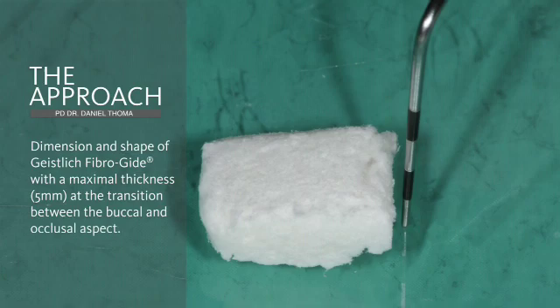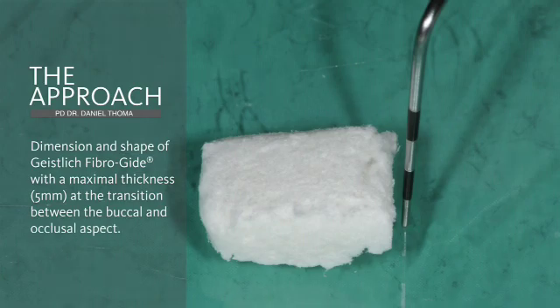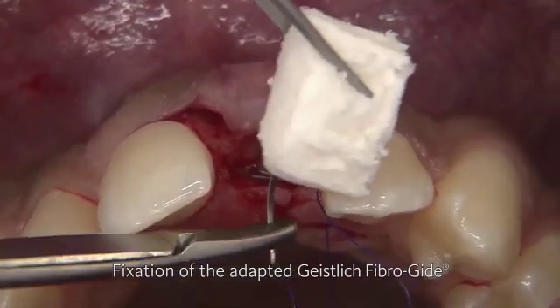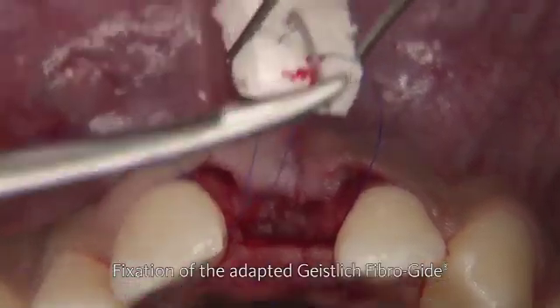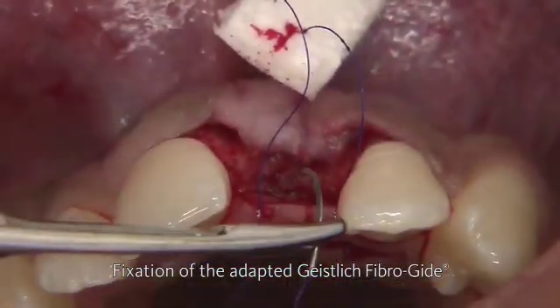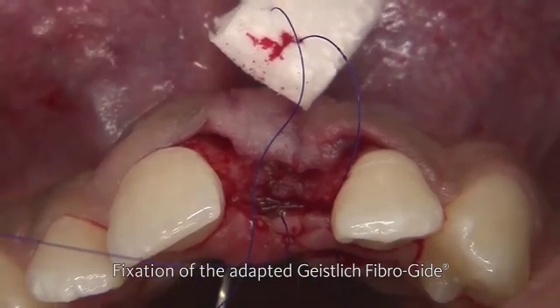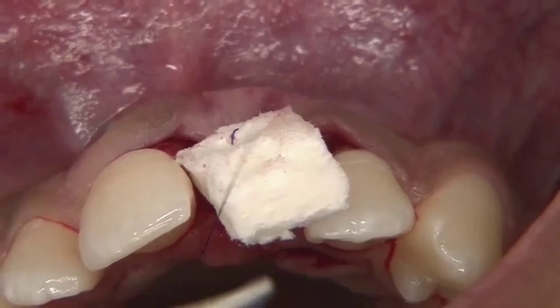Subsequently, the fibro guide is shaped to match the desired defect size, and thereafter the fibro guide is sutured using a horizontal mattress suture towards the palatal aspect. The entire matrix is then placed on the buccal side, inserting it into the pouch.